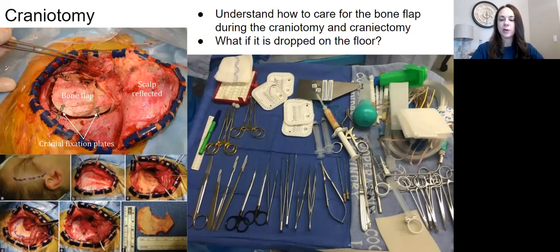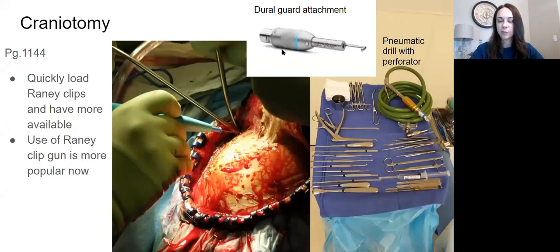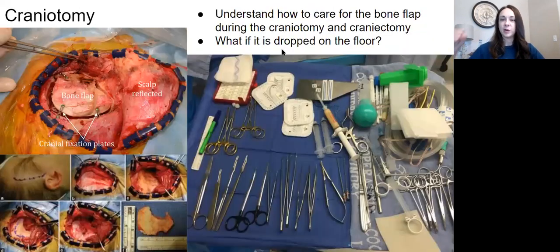So that's when you're going to put this side cutter attachment on, and they're gonna put in one burr hole, drill all the way around. You're gonna irrigate constantly until it's out. So then you have your bone flap out. The surgeons are doing their job, right? It's your job to take care of the bone flap. They may not say a thing to you. They take the bone flap off, set it on the Mayo. That is your job to secure that bone flap immediately.